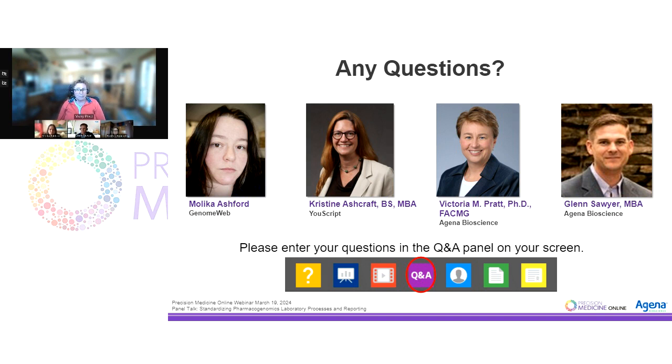I would just be cognizant when you're thinking about an exome platform. In my former group, we've done some validations on it. Many of the PGX genes have deep intronic variants that aren't covered well by exome platforms.